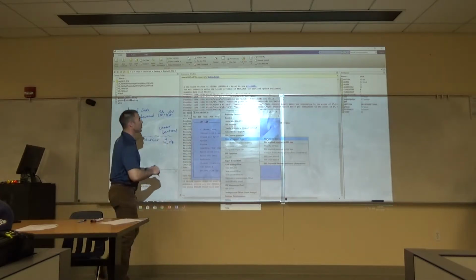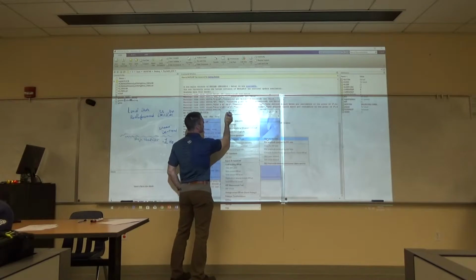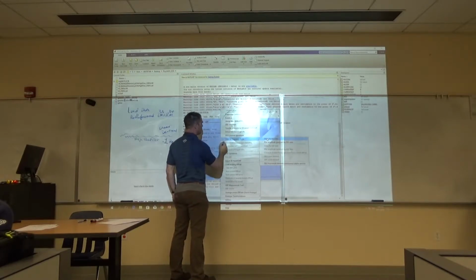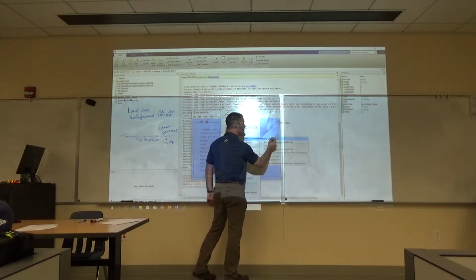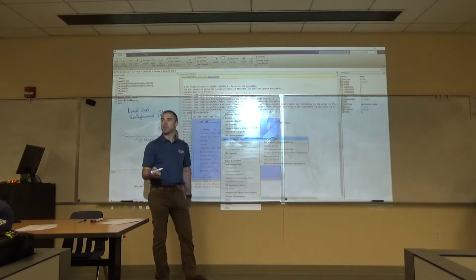So that's what we're doing here. We're coming to ERP lab, we're going to filter and frequency tools. Because we're not yet working with ERPs, but we're working with EEG data, that's going to be the option that we pick in our GUI.